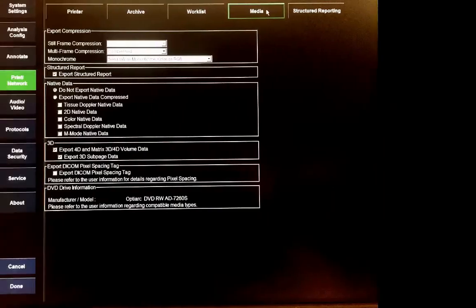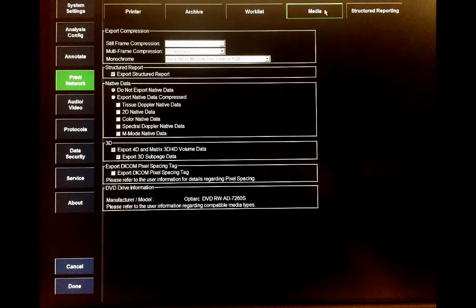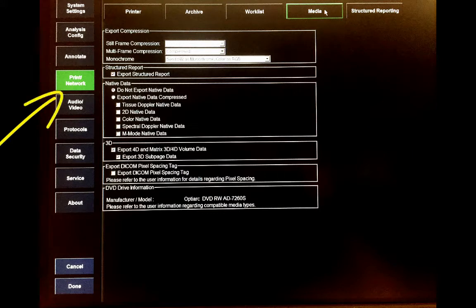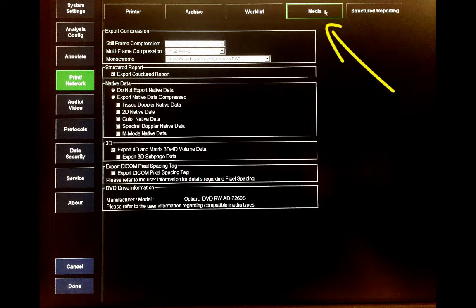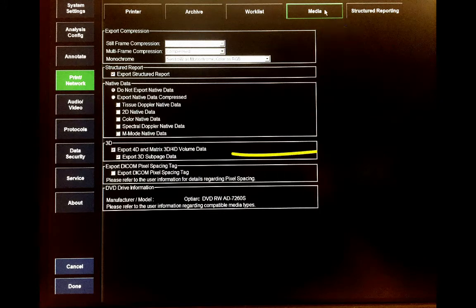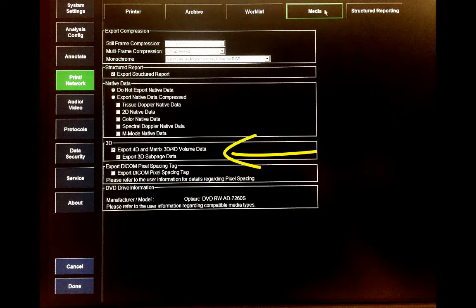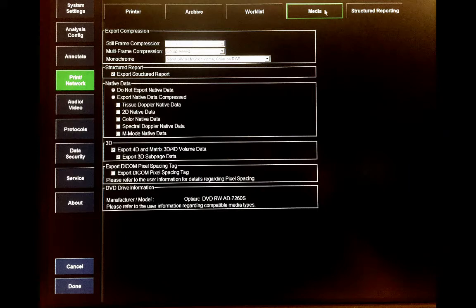This is the screen that comes up. Here click Print Network on the sidebar, and then click Media. Make sure under 3D, Export 4D and Matrix 3D/4D volume data is selected. Now you're ready to export raw 3D data.